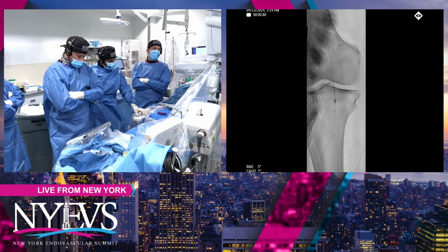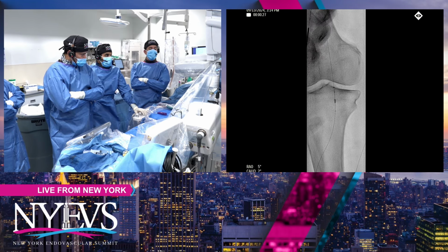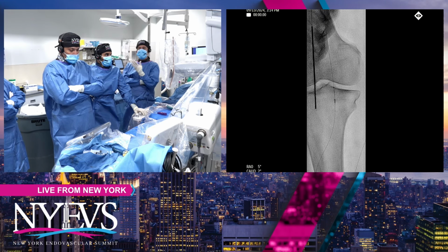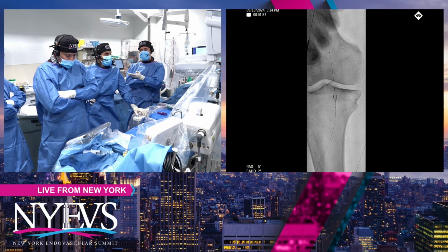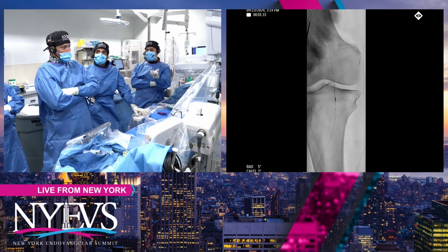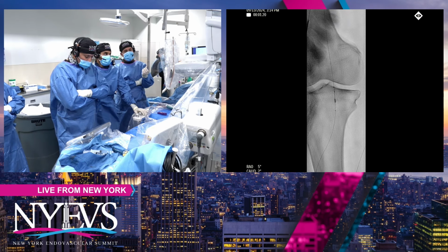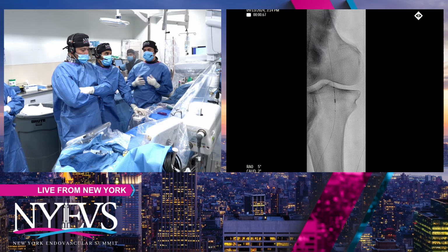Correct. So the idea was to be aggressive enough in dealing with this long segment ISR, trying to be aggressive enough in debulking the lesion. So certain devices, most of the times as of now for ISR, we're using Rotarex, which is an atherectomy and an aspiration thrombectomy device if there's a lot of thrombus, or laser. So if you want to use like a 2-2 laser, which in this case probably will be appropriate, we at least need a 7 French system.